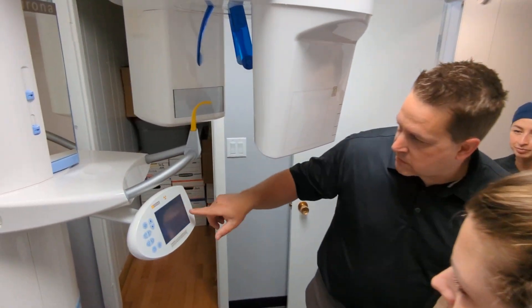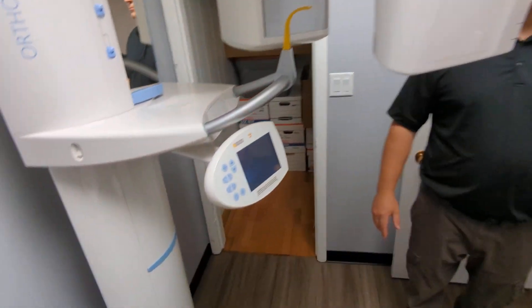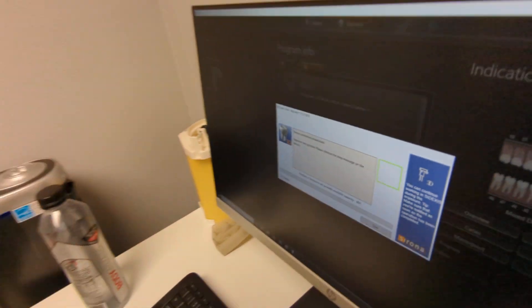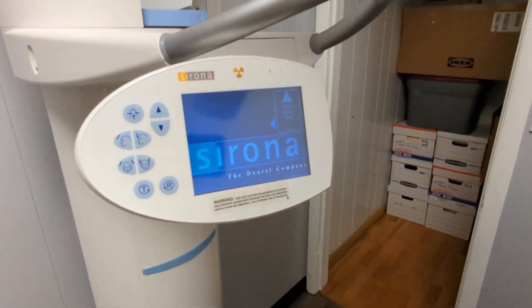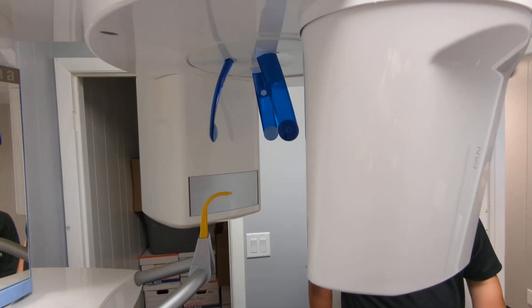It may say 301 — hit the R key. Because on the screen it says 'exposure not possible, please see help message' — it's saying 301. Some engineer put H301 instead of just saying 'hit R key.' We call it angry engineering.